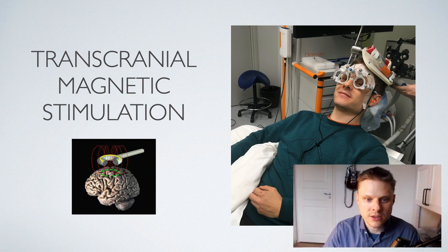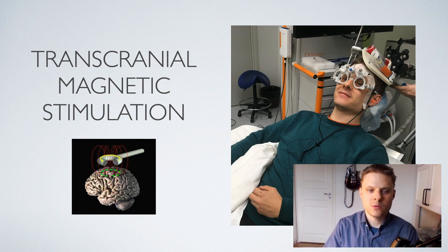However, the strength of the field decays with the second power of the distance from the coil to the target area. For this reason, we always get the strongest stimulation near the superficial regions of the brain. When performing TMS experiments, we need an easy way to detect that we have stimulated the brain. Two major requirements arise. The stimulation site in the brain should be relatively superficial, and the result should be a stimulation we can measure in some way.